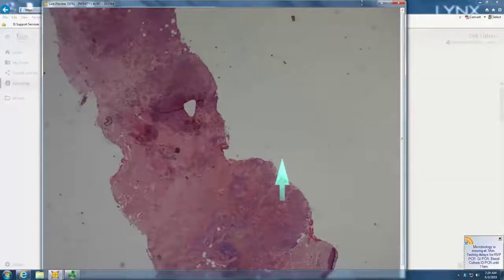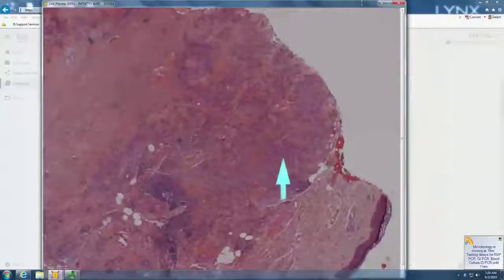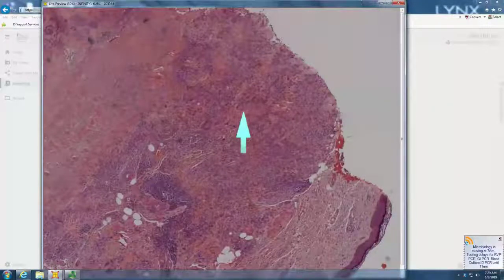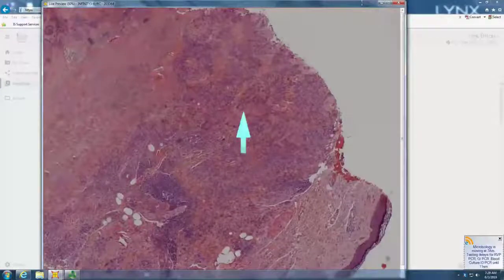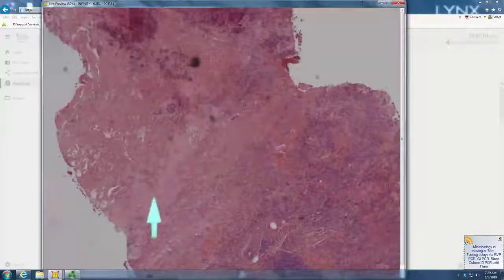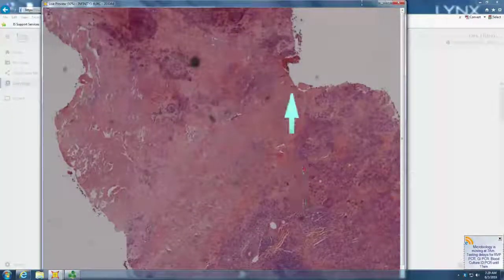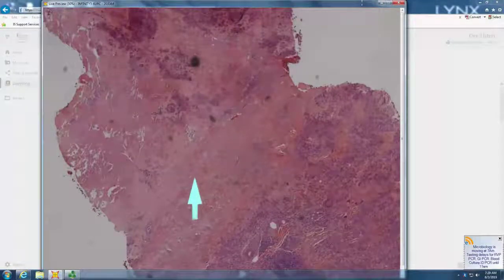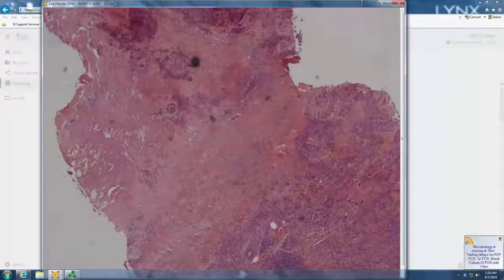Dermis and subcutis. So the dermis and subcutis, I see some ringed giant cells. Wreath-like giant cells, so it's a JXG, right? No. No, but it shares some features with XG. How about the collagen here? It's very dense and kind of necrotic looking. Yeah, kind of dead. And there's neutrophil debris on it, and there are cholesterol clefts.